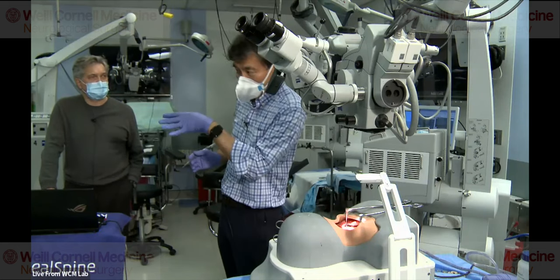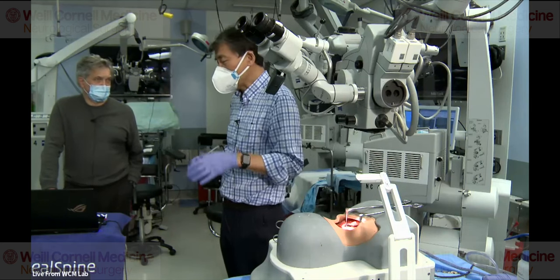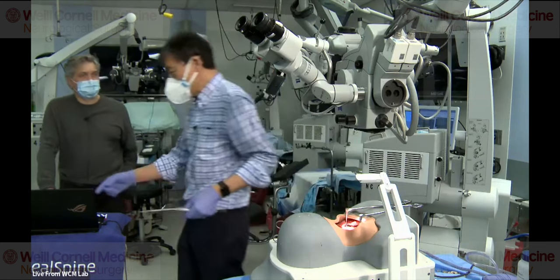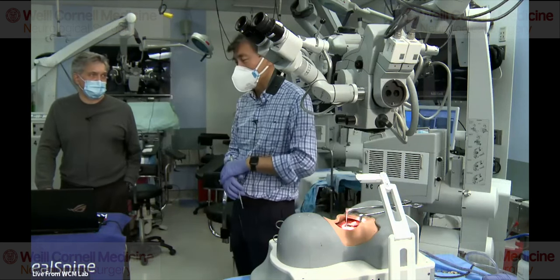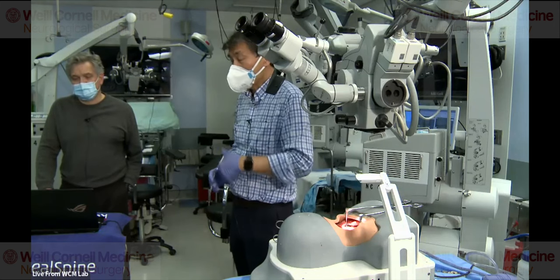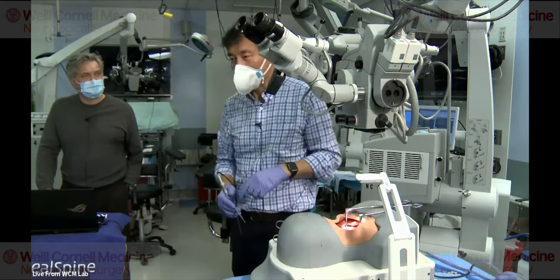And even when I see that somebody's contaminated a little something, just a split second, like they're walking across and the little tail from their gown touches something, it probably didn't get anything. Normally I would have said, take that gown off or put a Steri-Strip on it or something like that. Now I don't even worry about it. And of course you irrigate constantly. During this entire procedure, you irrigate at the end, and I'll point that out again.